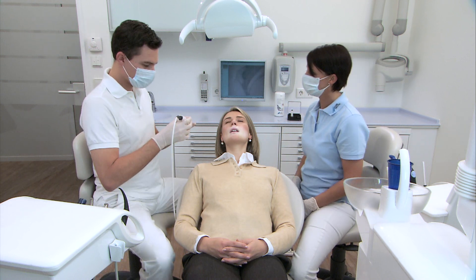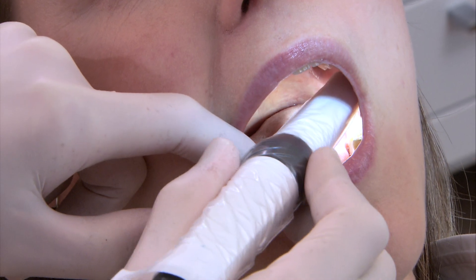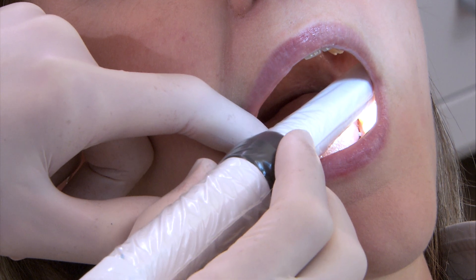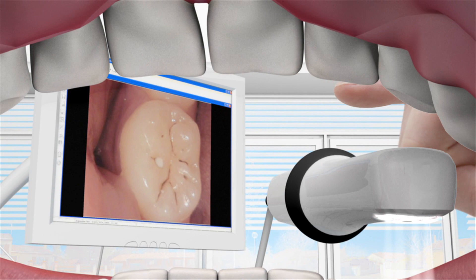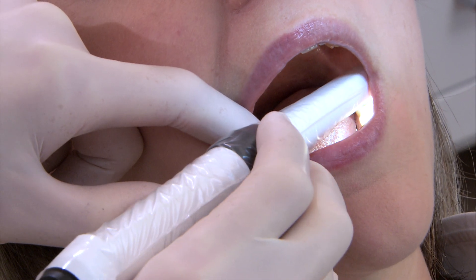Whether taking still or live images, video clips or for memory storage, using the manual trigger you will be able to work in a relaxed and ergonomic way in all treatment situations. A simple press of a button is all it takes. The practitioner rotates the camera, not his or her hand.